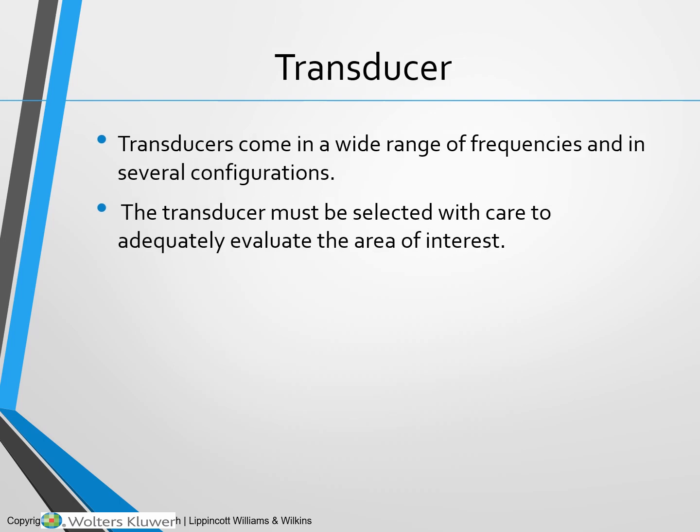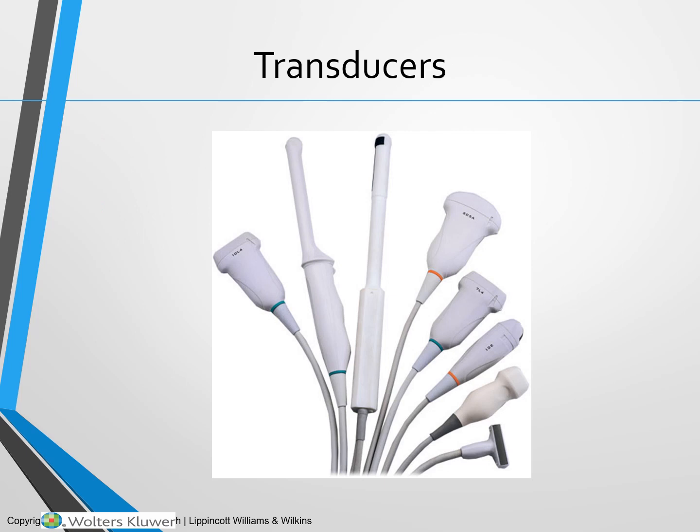The transducer is what you'll be scanning with and actually placing upon the patient's body to create the ultrasound image. And these transducers come in a wide range of frequencies and in several different configuration types. The transducer must be selected with care to adequately evaluate the area of interest. So depending on what you're going to be scanning depends on the type of transducer that you'll choose. So here are some examples of transducers and the different types that you may use. Depending on what you're scanning will dictate your transducer selection.